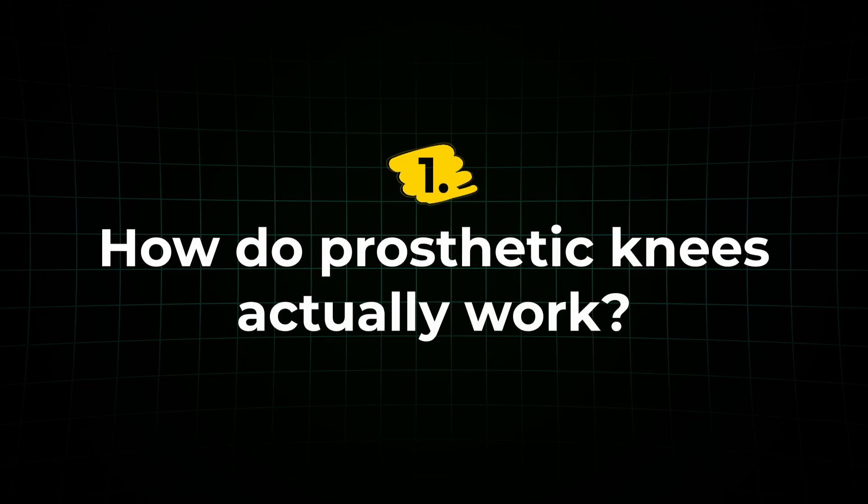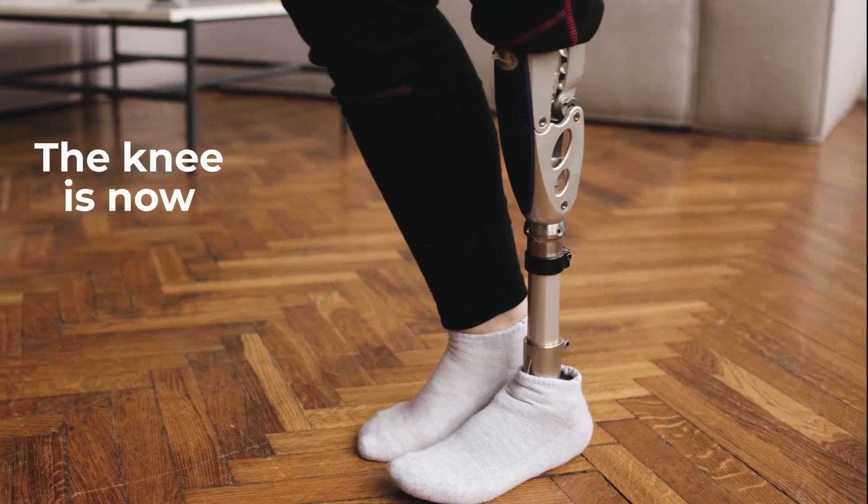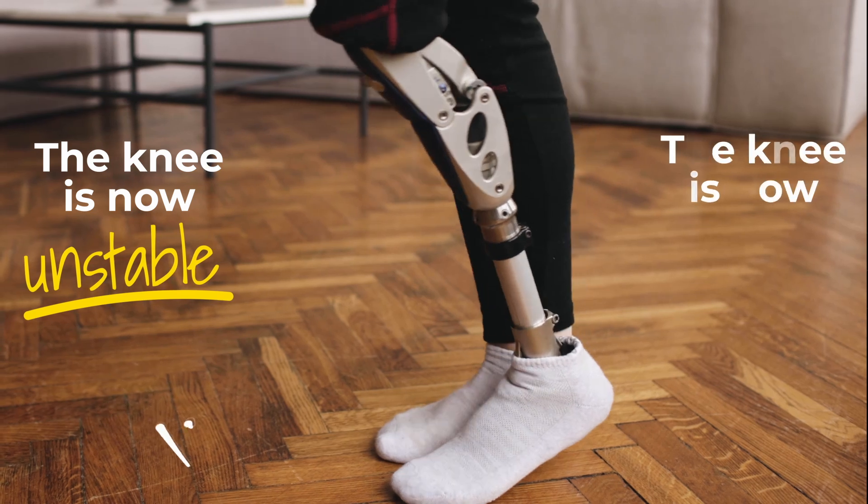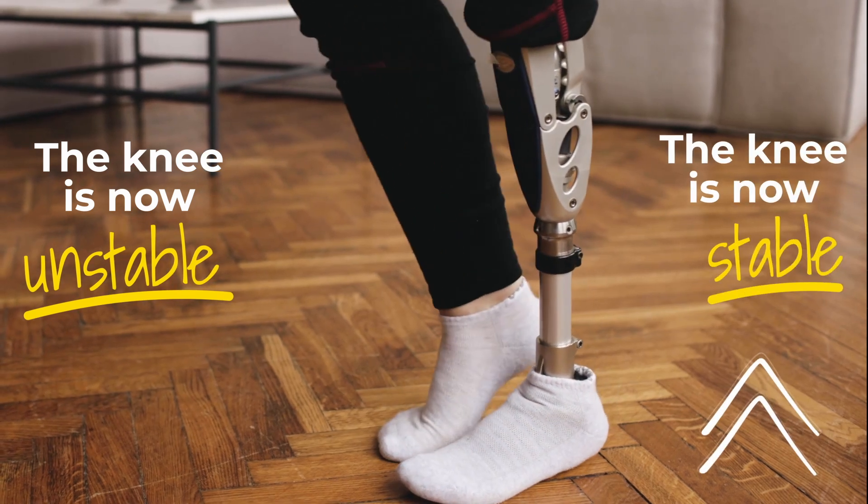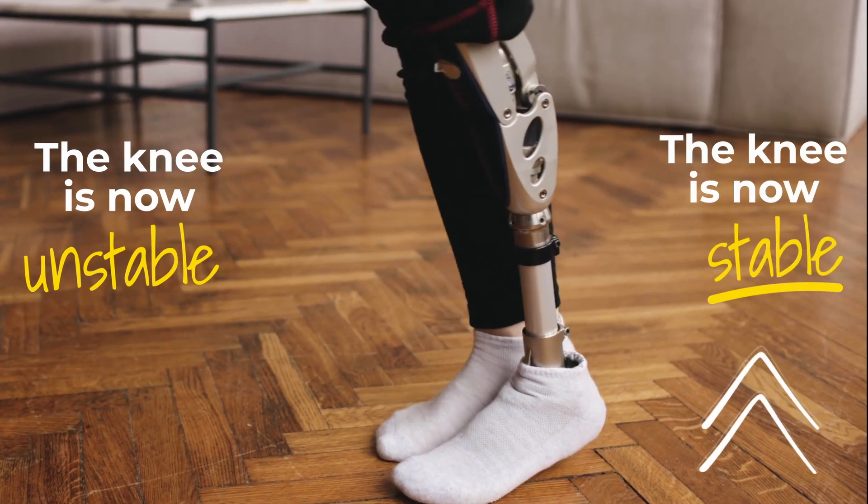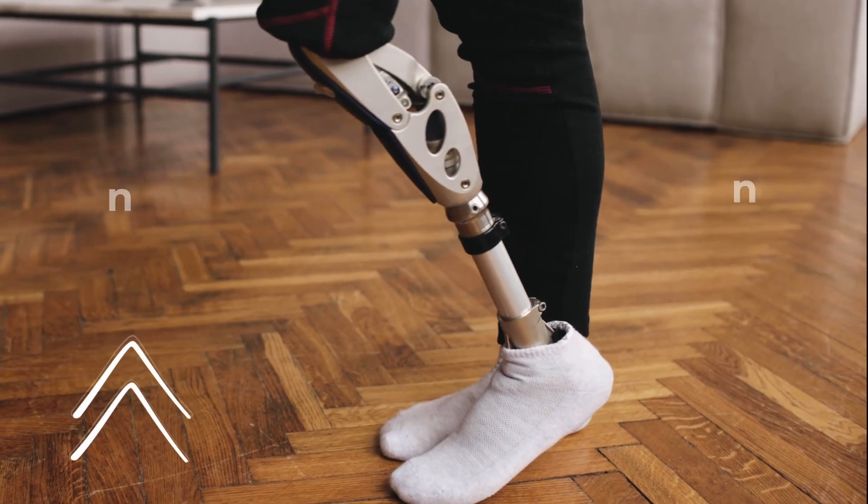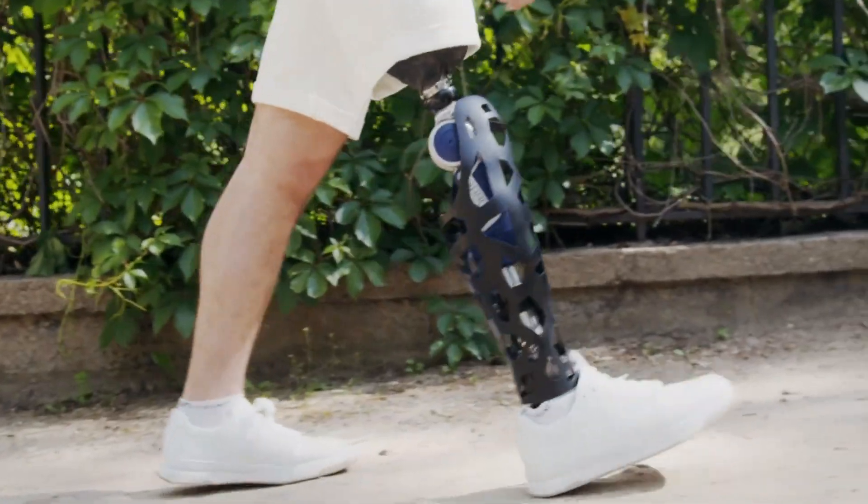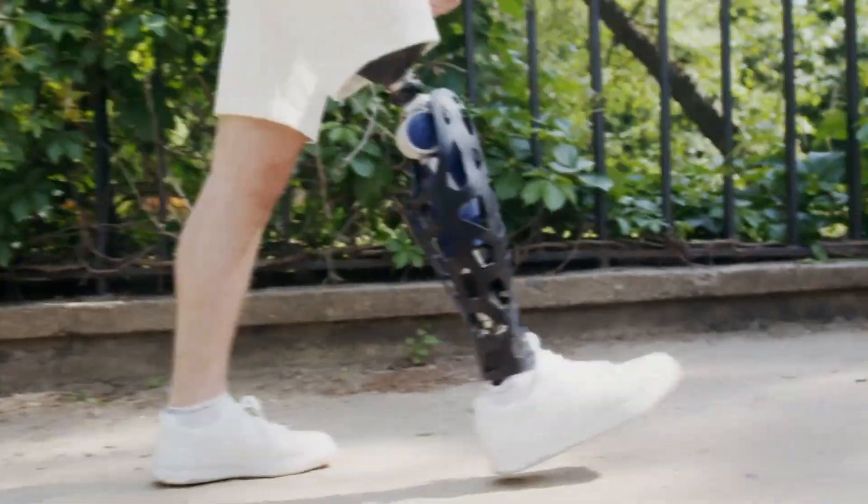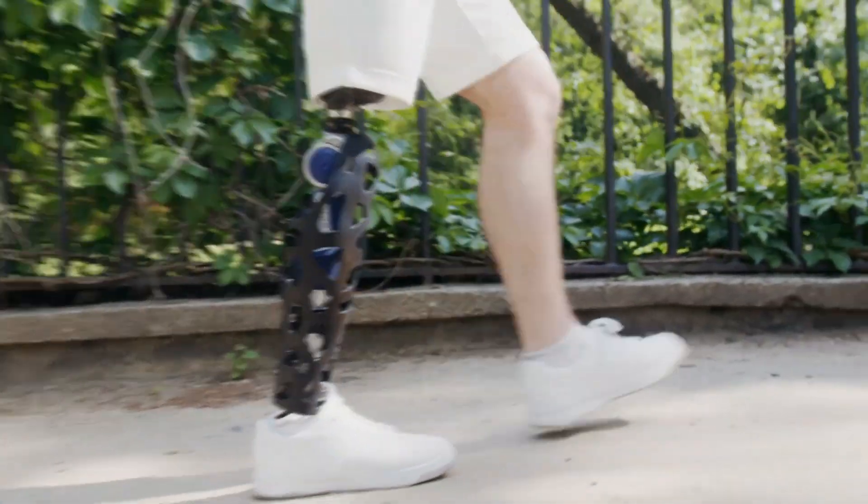Today, we are going to uncover the brilliant mechanics of one of the smartest pieces of orthopedic technology. You will learn how polycentric knee joints work, why they are so damn brilliant, and by the end of this video, you will never look at walking the same way ever again.